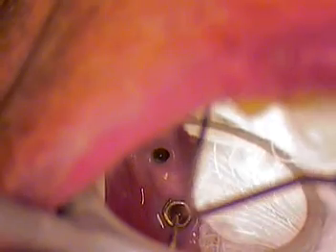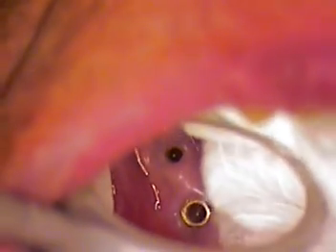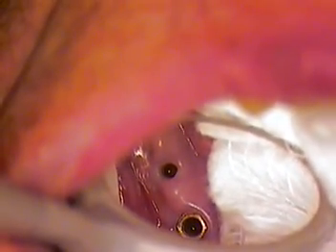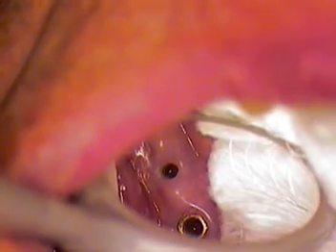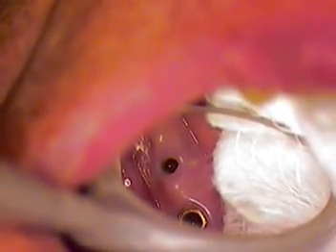We're about a minute into it, so I've got another 18 minutes to go. I'm going to stop filming at this point, come right back with Larry, and we'll see if we can get these screws loose today. It looks good — promising for one, we've got to see the other one in a little bit, and we'll come back at the next.